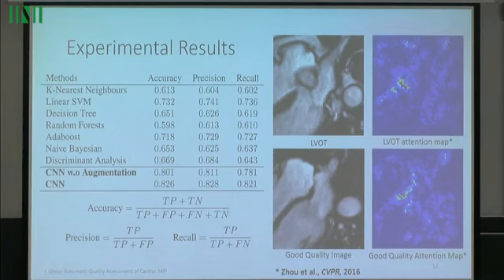On the top image, we can see the emphasis is on the aortic region, so the classification is done according to the high gradients in the aorta region. The same can also be said for the good quality image. The emphasis is on the distinction between the atrial chambers, which shows a good quality image for 4-chamber acquisitions.